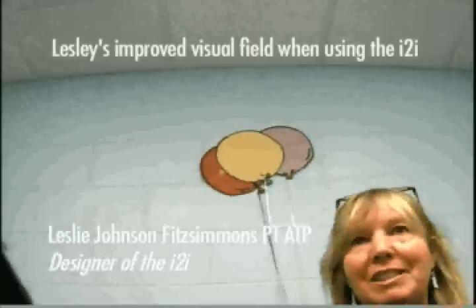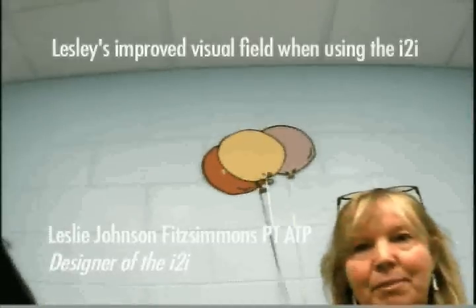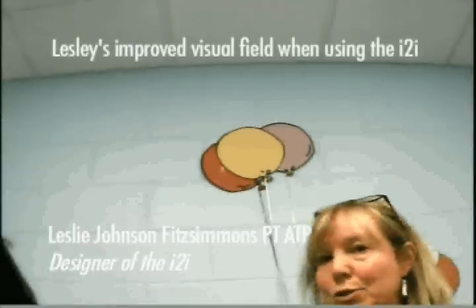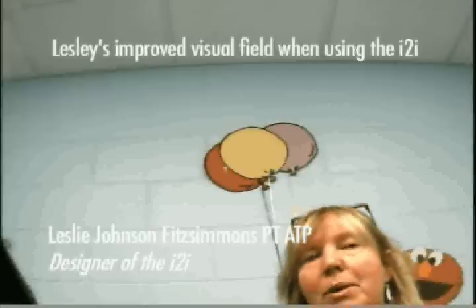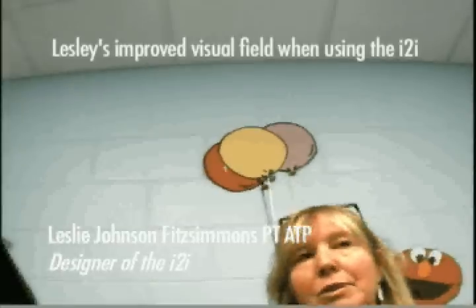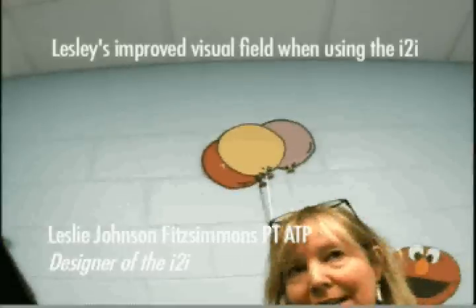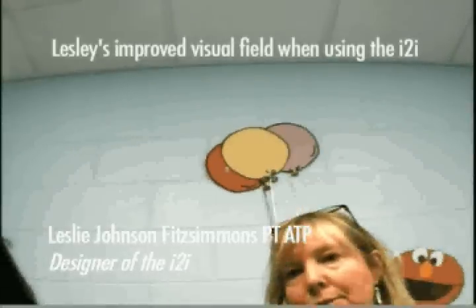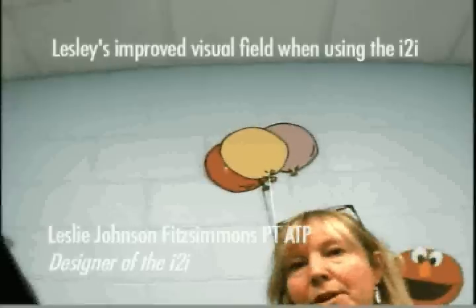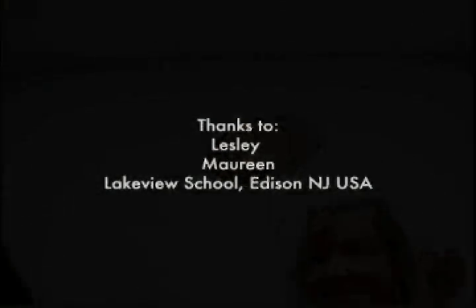We want to point out the difference between the two: when Leslie's head is upright, she can make eye contact and is engaged for socialization, for learning, for teaching — that's so much better than when you saw before, when she was looking at the floor, someone's feet, her tray, sideways. You can see there's a big improvement and a much greater opportunity for Leslie to learn when her head is in an upright, eye-to-eye position. Look at the connection.